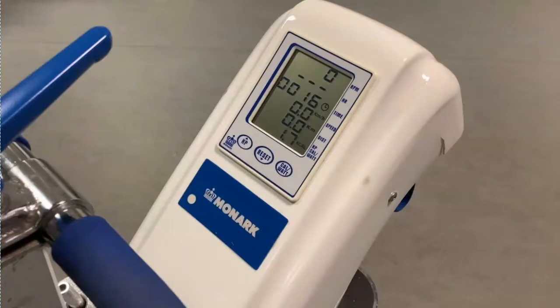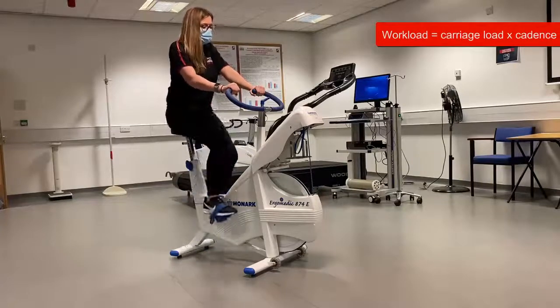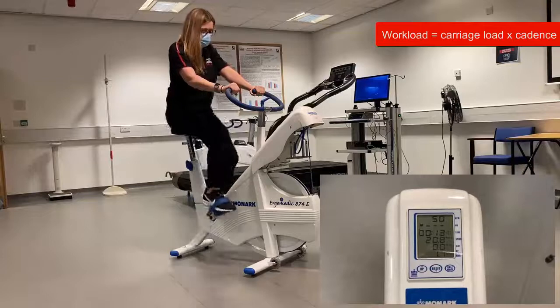Next we will look at how to control the workload. Workload is controlled by placing calibrated weights on the suspended carriage, as well as by cadence. Commonly throughout a test we will ask participants to maintain a set cadence, and therefore to control the workload we simply adjust the weight.